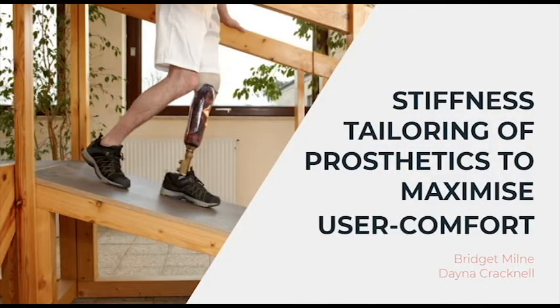However, residual limb tissue is not accustomed to these imposed loads, which can cause discomfort for amputees. Today, we will be discussing how we approach the problem of discomfort experienced with the use of transtibial prosthesis.